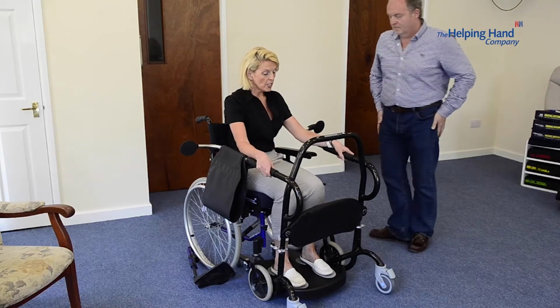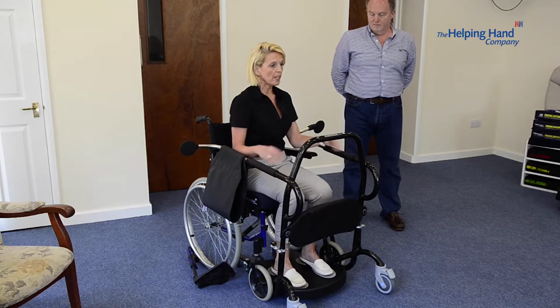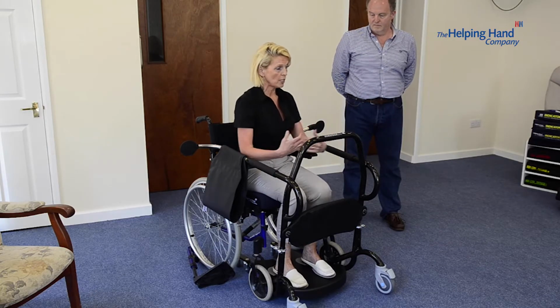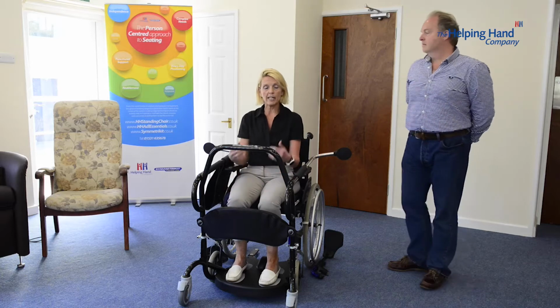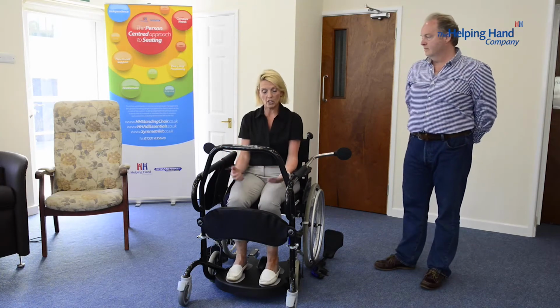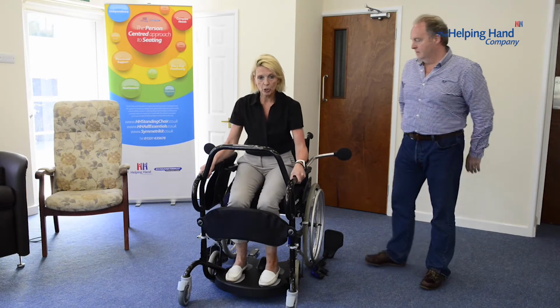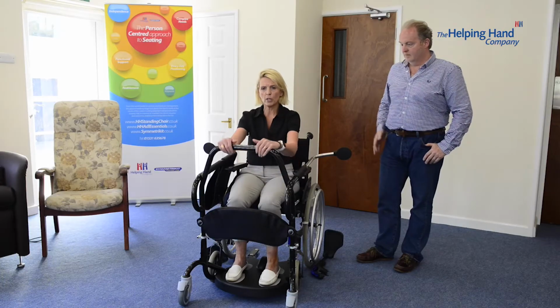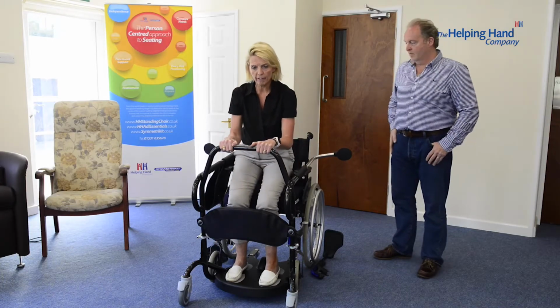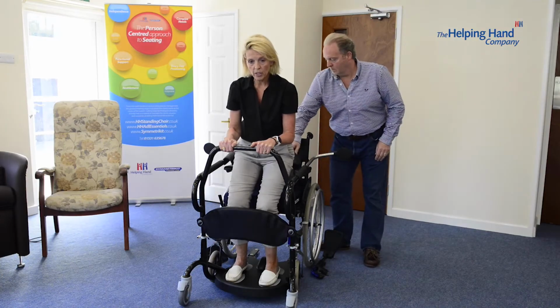At this point, I may need to move myself slightly forward so I get myself into a good position to initiate that stand. But again, that setting's nice. I'm not leaning back, I'm not leaning forward, my feet aren't dangling, they're firmly planted. At this point, I can be pushing up or I could be pulling up. It's more likely that I'm going to pull myself up. Again, I only need to achieve a half stand.